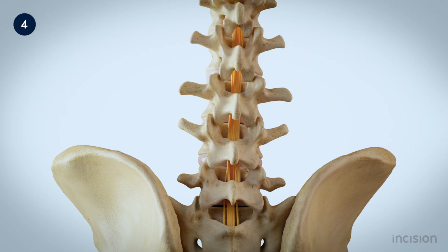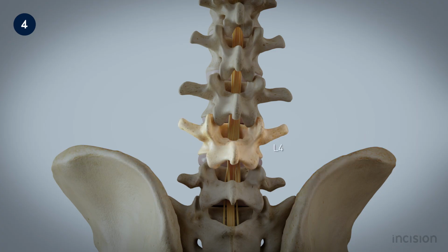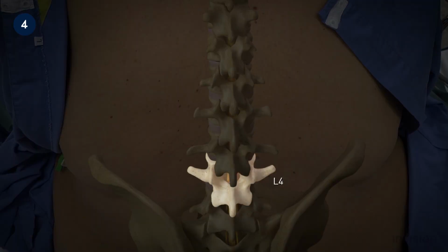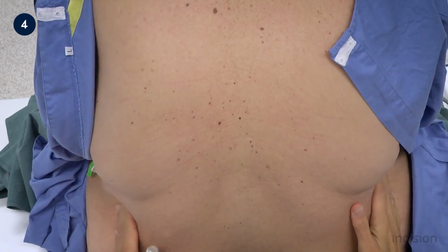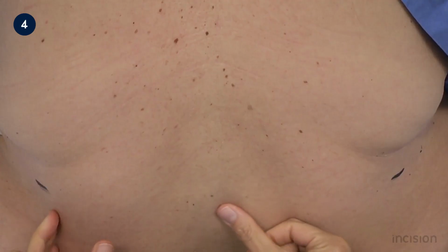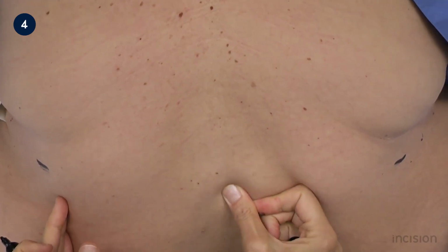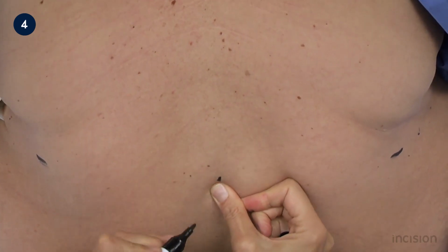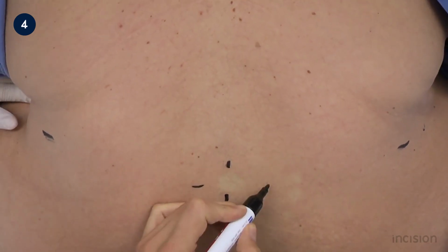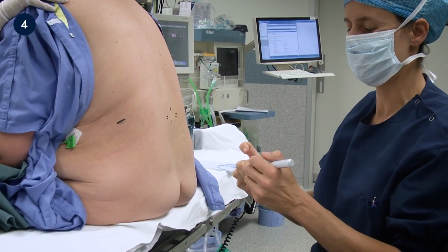Here the pelvis and the lumbar vertebra are seen from posterior view. The intercrystal line is an imaginary line between the highest points of the iliac crests. It approximates the level of the L4 vertebral body and is used to identify the other vertebra. The iliac crests are palpated. The anaesthetist marks the level of both on either side and palpates the spinous process of L4 in the midline. The spinous process of L4 is now marked, as well as the spinous process of L5. The interspinous space between L4 and L5 has now been identified.